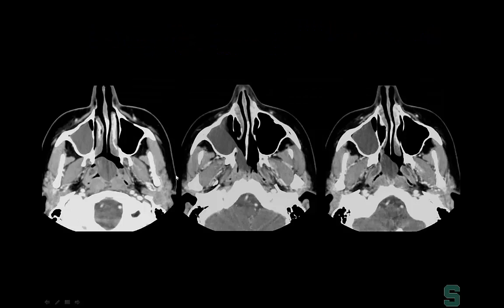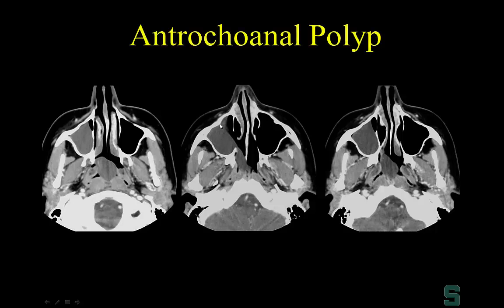Here is a lesion extending through the primary ostium of the maxillary sinus into the nasal cavity — this is an antrochoanal polyp, extending through the antrum of the maxillary sinus through the choana.